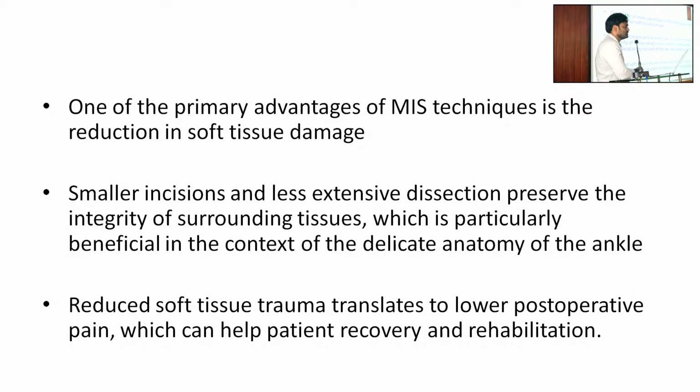But here, what plates have they used for the minimally invasive technique? Is the plate normally available here? We have very thick plates. Even now we have thick plates. You can't get the plate underneath the skin, especially as the fibula is such a small bone. Without opening the fibula, you can't do it. But at least it doesn't have much soft tissue to strip. Yes, no muscle cover. Submuscular stripping cannot be done for the fibula.